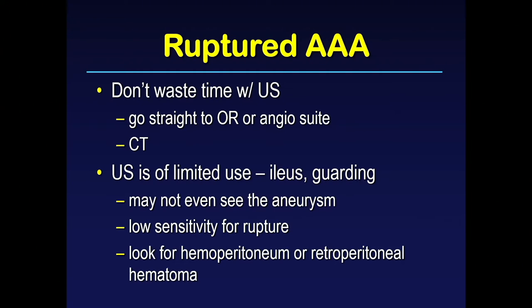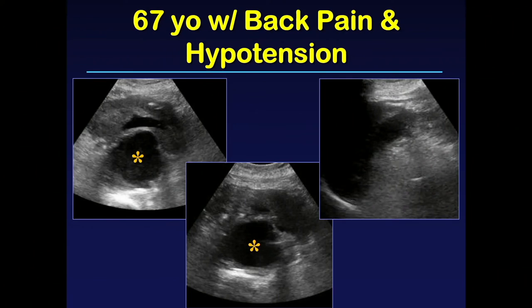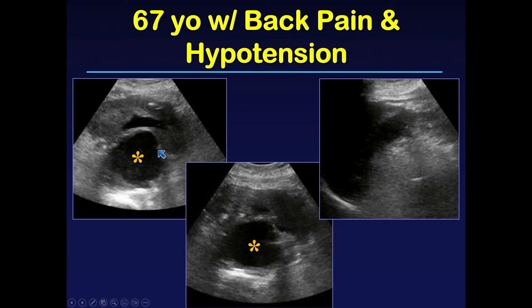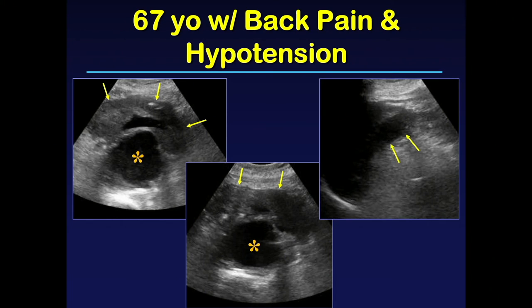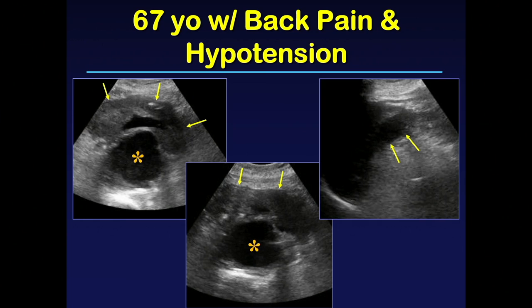What you are reduced to doing is looking for secondary signs of rupture, namely hemoperitoneum or retroperitoneal hemorrhage. Here is an example where we could actually make the diagnosis in a patient presenting with back pain and hypotension. You can see the abdominal aortic aneurysm, on top of which is a heterogeneous crescent-shaped clot, and some complex fluid in the region of the splenic hilum consistent with hemoperitoneum. We don't see this very often, as patients typically go directly to the operating room or angio suite.